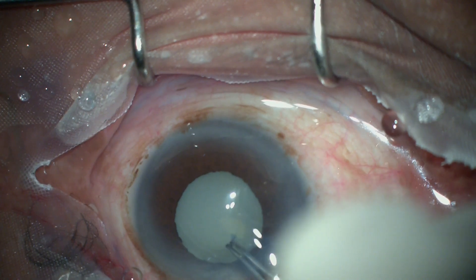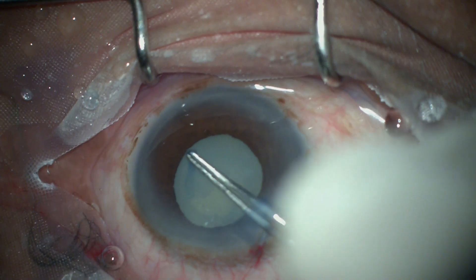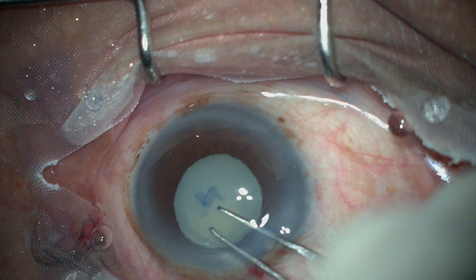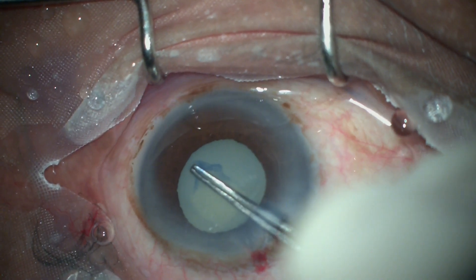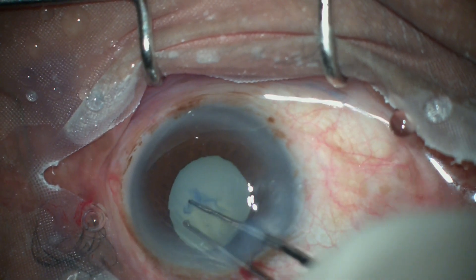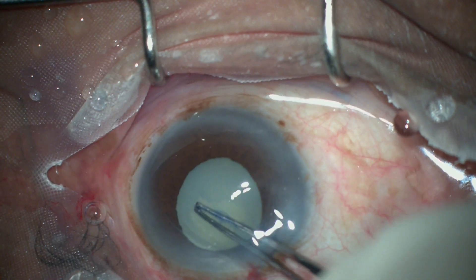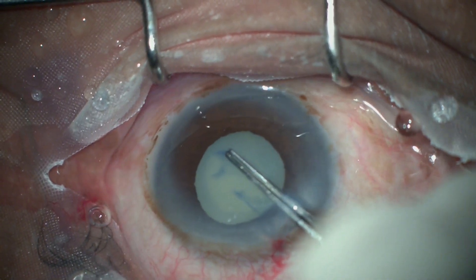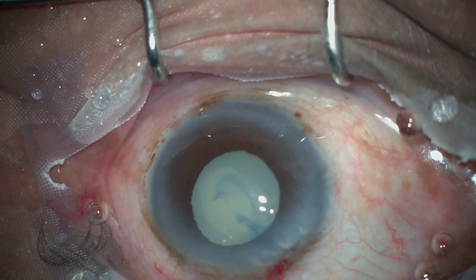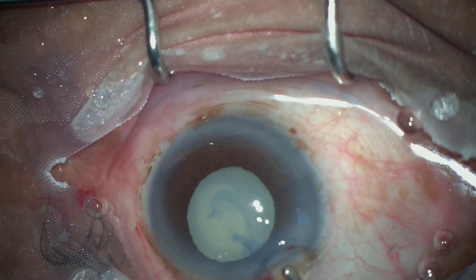In spite of creating the flap and propagating it, the cortex is still there — it should have leaked out profusely as happens in hypermature Morgagnian cataracts. This indicates a lamellar capsule: there are two lamellae, the superficial one which has been stained and the deeper one which is intact. This is known as true exfoliation syndrome — a unique situation I was not prepared for.